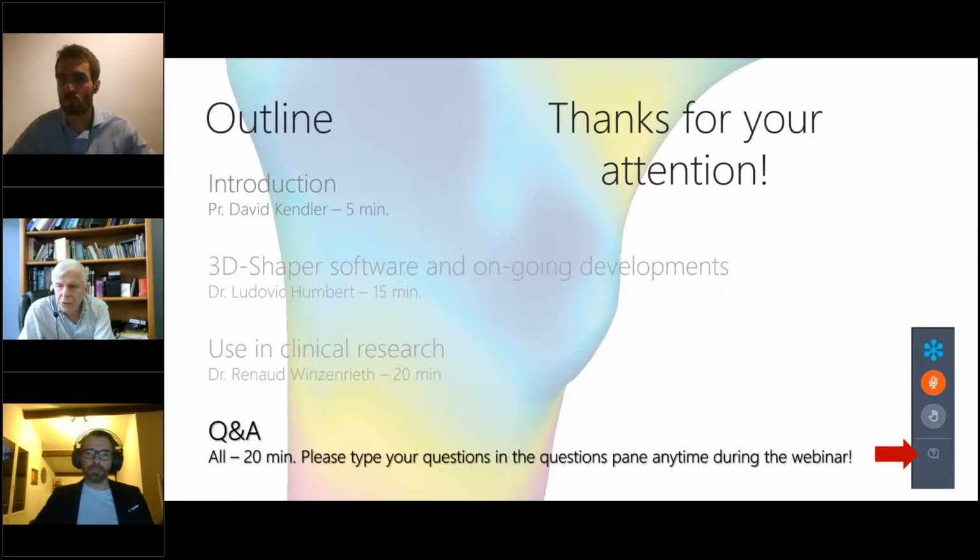Okay. So Renaud, a question for you from Dr. Stier and from Mary Buchsien about different races, and whether you have data on people other than Caucasians or Spanish people. You've got some Japanese data, obviously. Can you make a comment there? It's a really good question. To date, the average 3D model we use is from the population that we registered, and we have only Caucasian people. So this is one limitation of our methodology, that we don't have other ethnicities included inside the model.